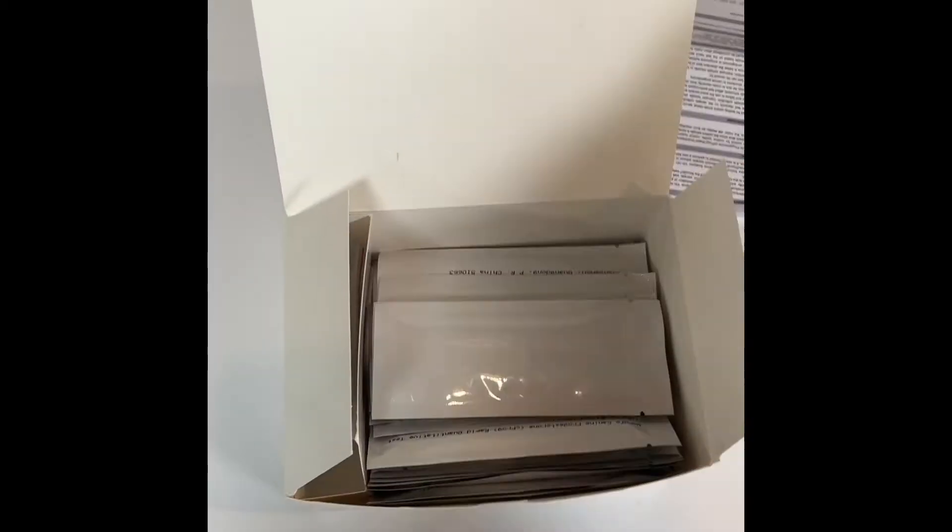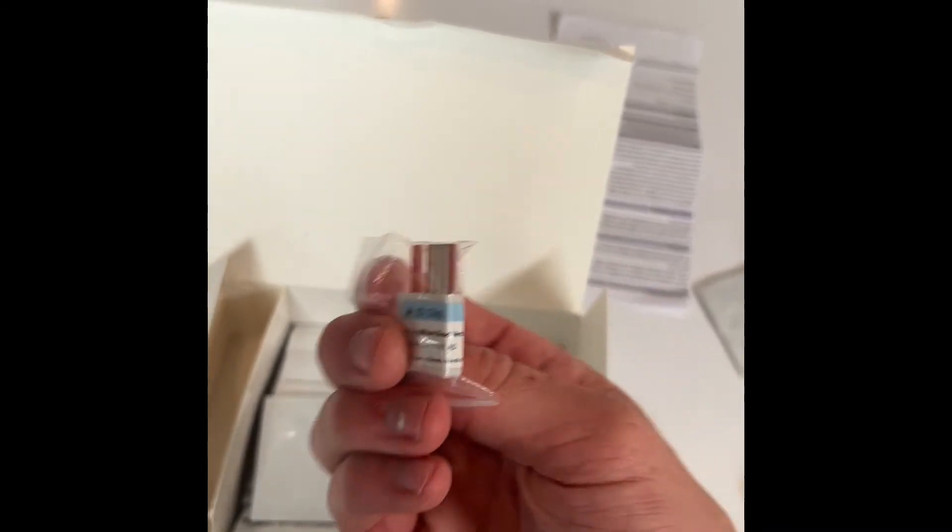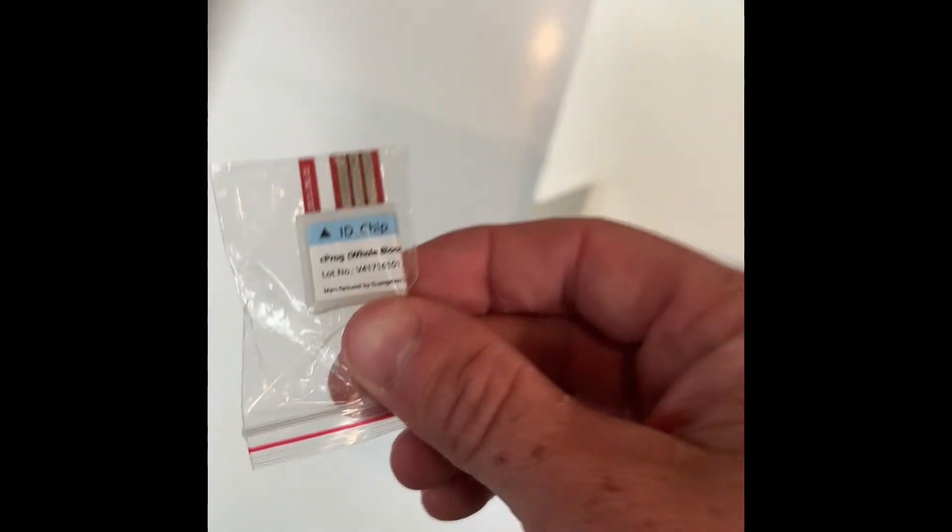Let's take a quick look into the actual box. It's going to include 25 tests, 50 pipette tips, and 25 buffers, as well as the important piece — the whole blood ID chip. Make sure you're using this ID chip when running the whole blood, because this is what makes the whole blood kits accurate.